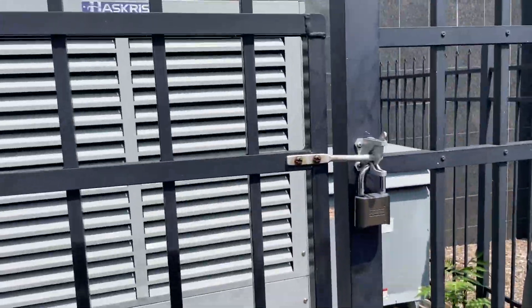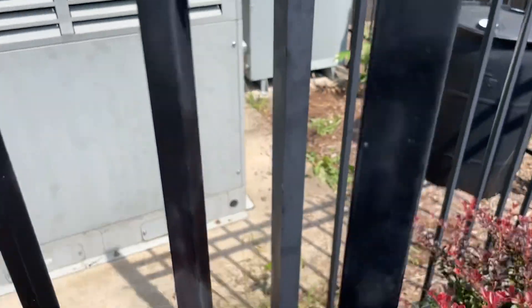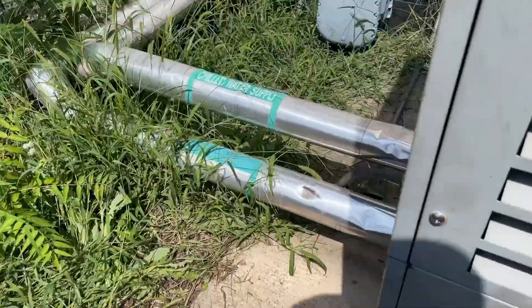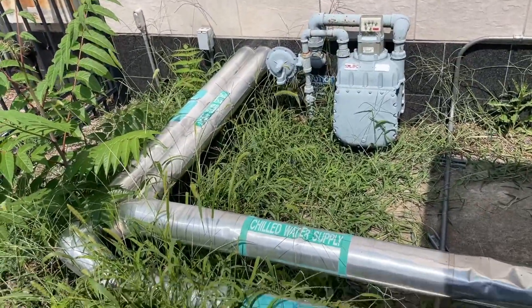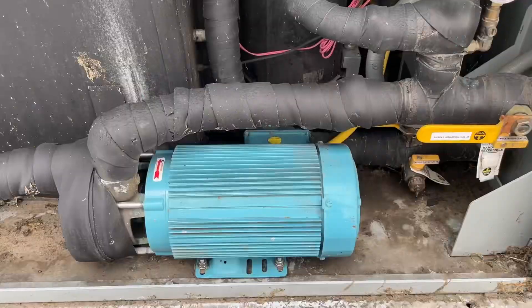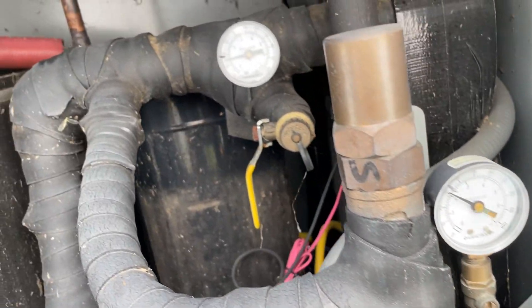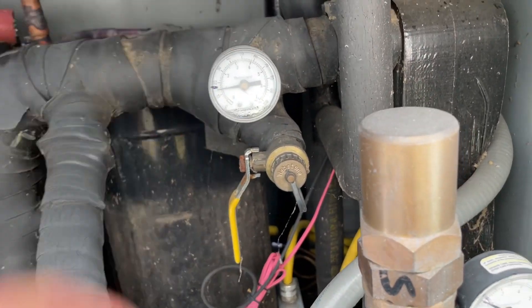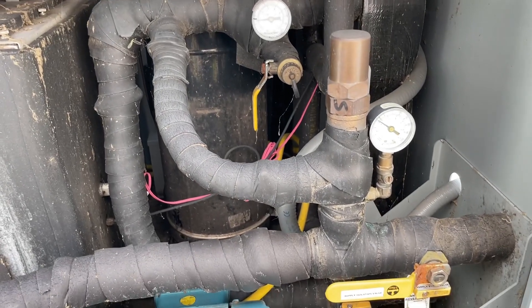Let's get in here via these screws. The pump's running. The needle's a little bit off from where somebody marked them, but not terrible. Maybe it does need a little makeup water.